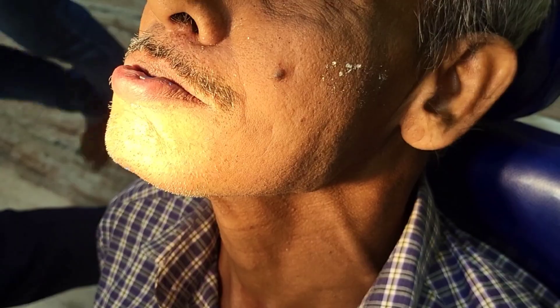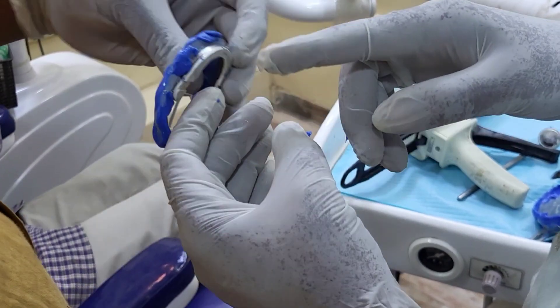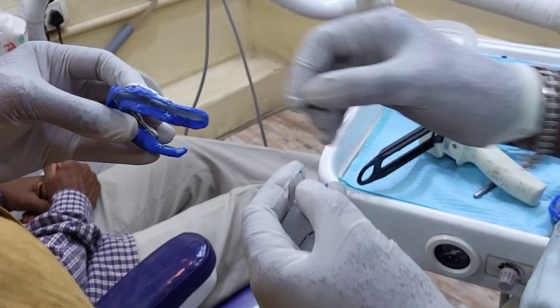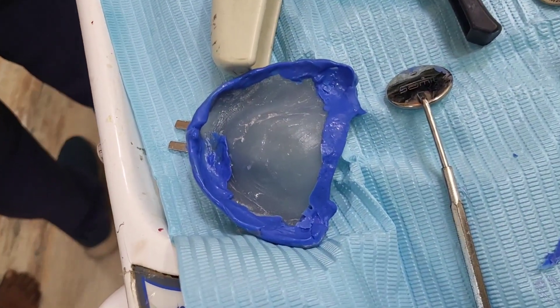Once the material has set, we have to remove the tray and inspect where the tray has been exposed — meaning areas where the material has not flowed over. We have to trim the tray again at those areas and redo the border molding, particularly on that side.